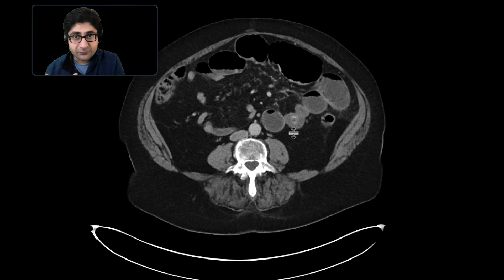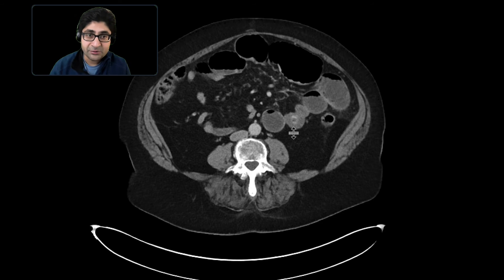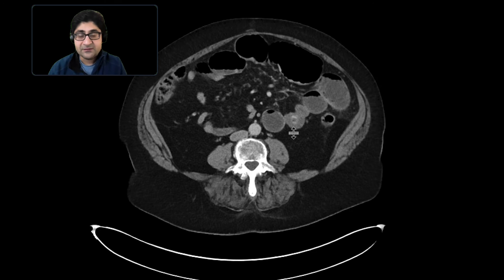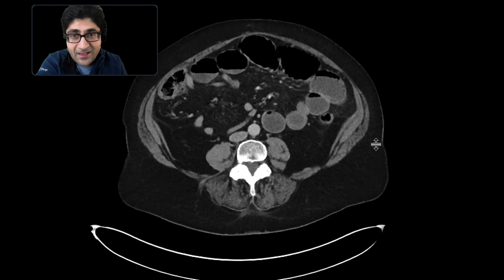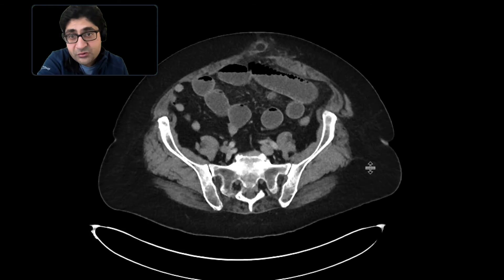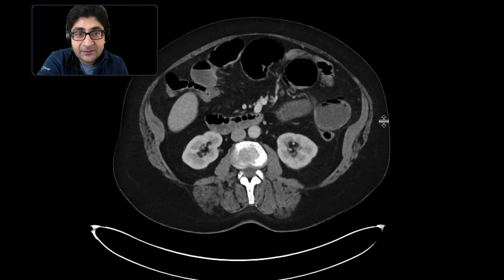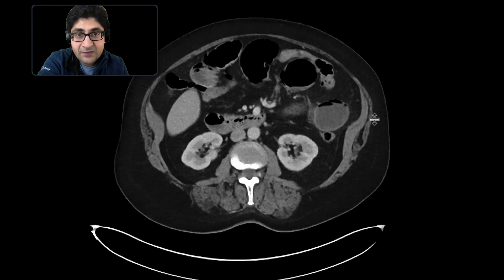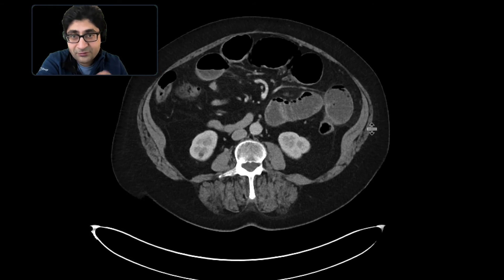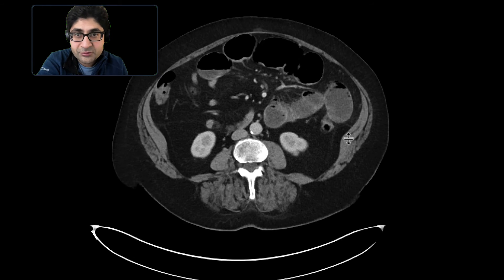Put that in the context of the gallbladder having air, having a fistula to the duodenum, and having pneumobilia in the biliary system. These findings are classic for gallstone ileus — a type of small bowel obstruction that occurs in the context of a gallstone lodged in the bowel, resulting in the obstruction.